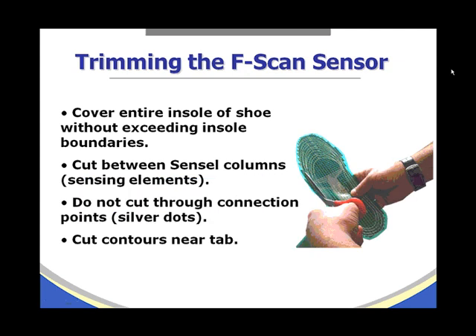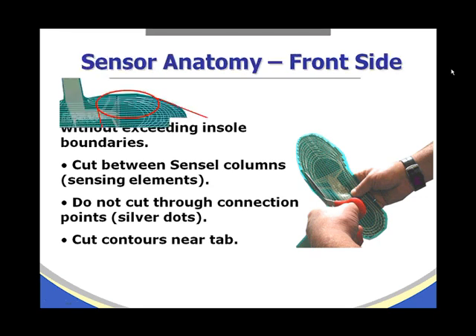When trimming the F-scan sensor, the goal is to cover the entire insole of the shoe without exceeding the insole boundaries. We want to cut between the sensor columns, or sensing elements, and we do not want to cut through the connection points, or the silver dots. We also want to make contour cuts near the tab.